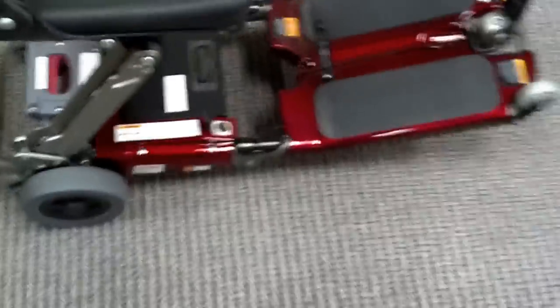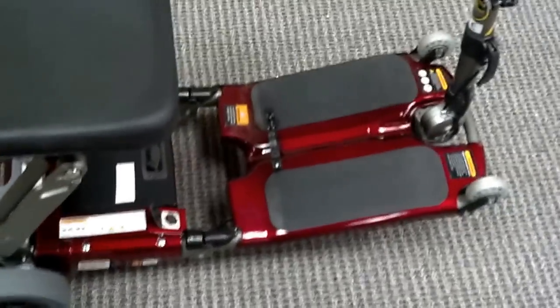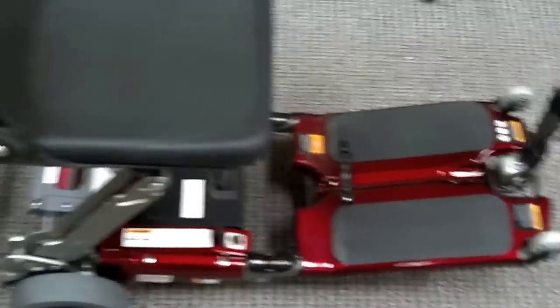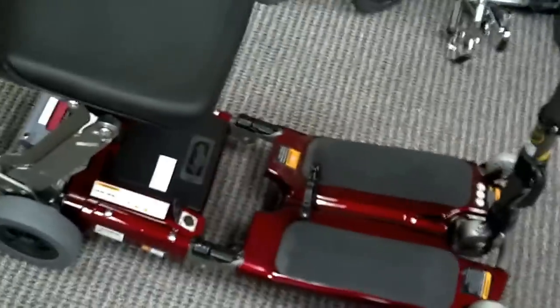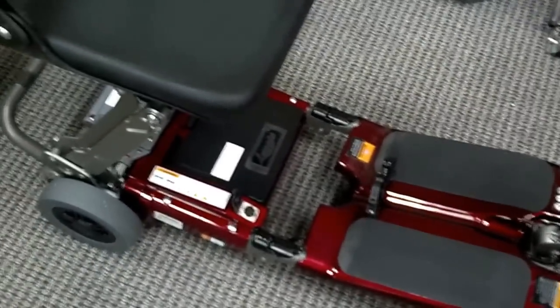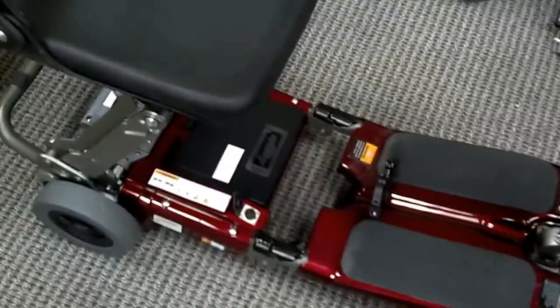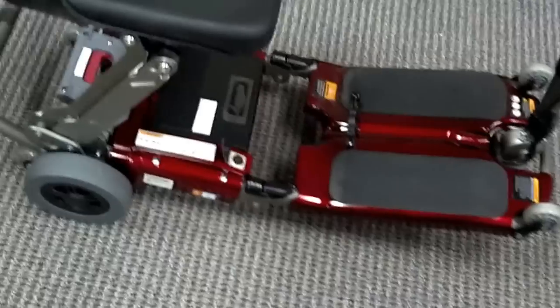Hello, today we are going to be talking about the world's smallest portable scooter, and this is called the Luggy. We just recently received this today from a company that we were aligned with in regards to providing the Luggy nationwide via rentals and purchasing.